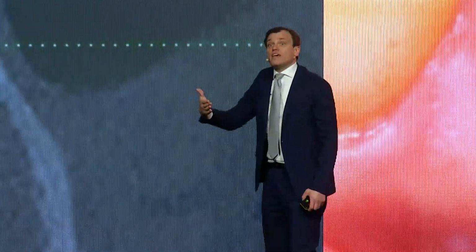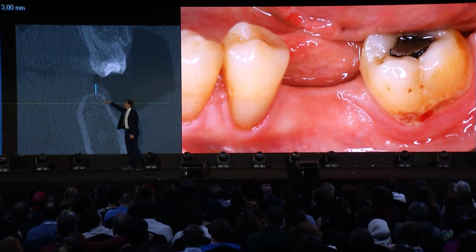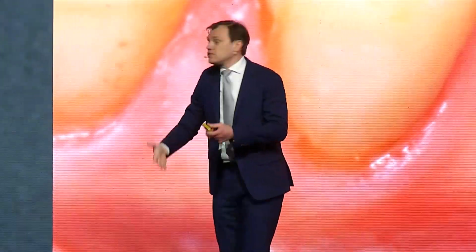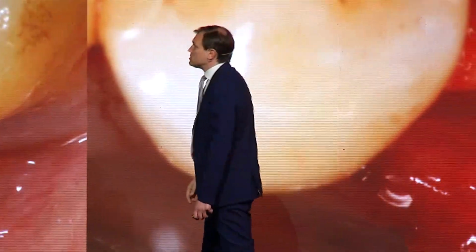Now I would say that I need 4. So today, in this case, I would place the implant 1 millimeter below the bone, and that's all. That's how we get 4 millimeters. But back then, 5 years ago, 3 millimeters was still the threshold between thin and thick. That's why we included those patients.